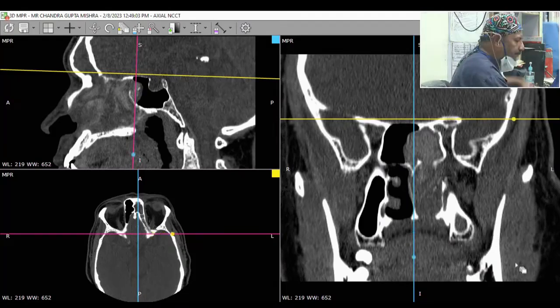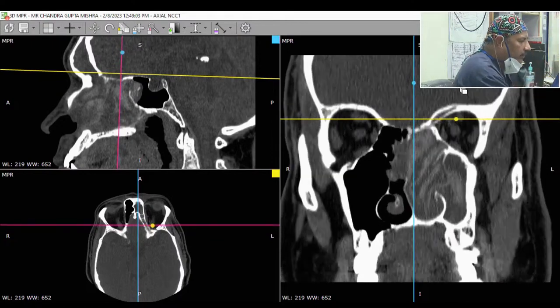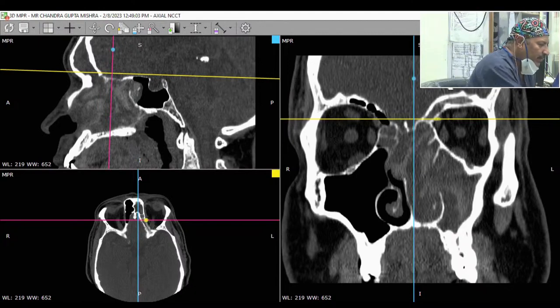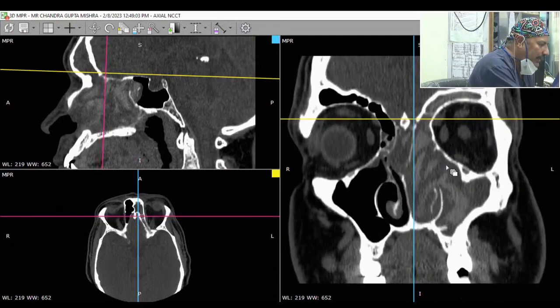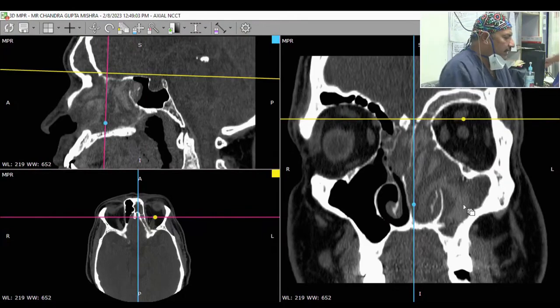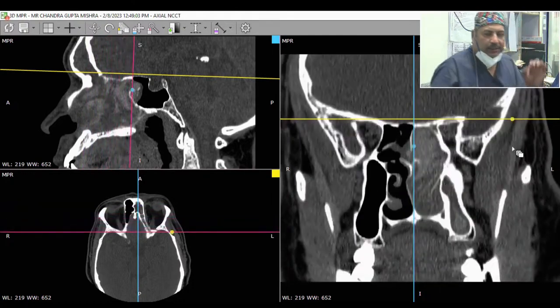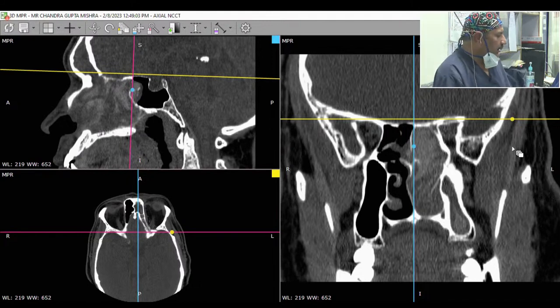Correct. And you see, this is what we discuss. Any query about allergic fungal sinusitis, I am not describing the CT scan in detail. We'll be looking at the CT scan before every case, and some finding I will keep highlighting. So this is the first case: the maxillary sinus, frontal sinus, ethmoids, classical unilateral allergic fungal sinusitis. Any questions?